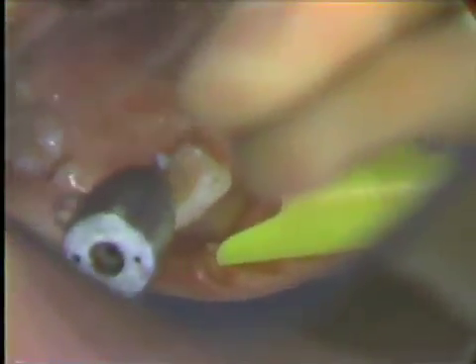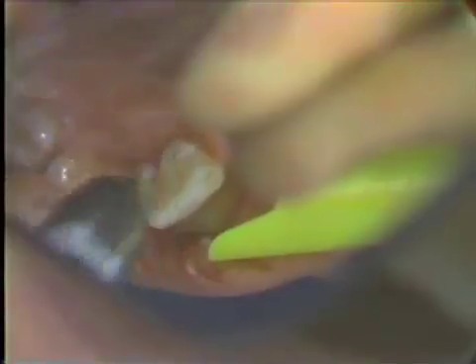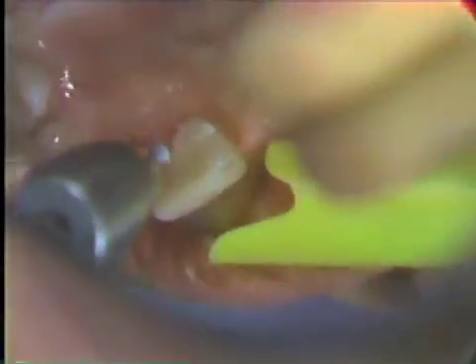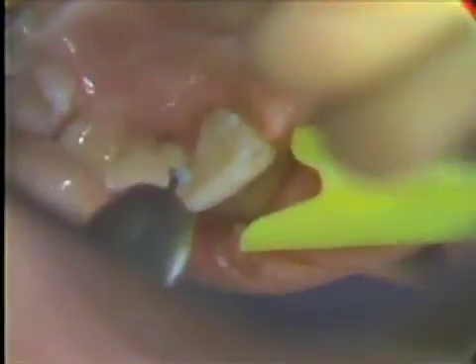We'll get our cingulum ledge the same way, remembering that we'll need about a millimeter, because we're going to take a half a millimeter off on the lingual surface, and we'd like to have about a half a millimeter left for the ledge.